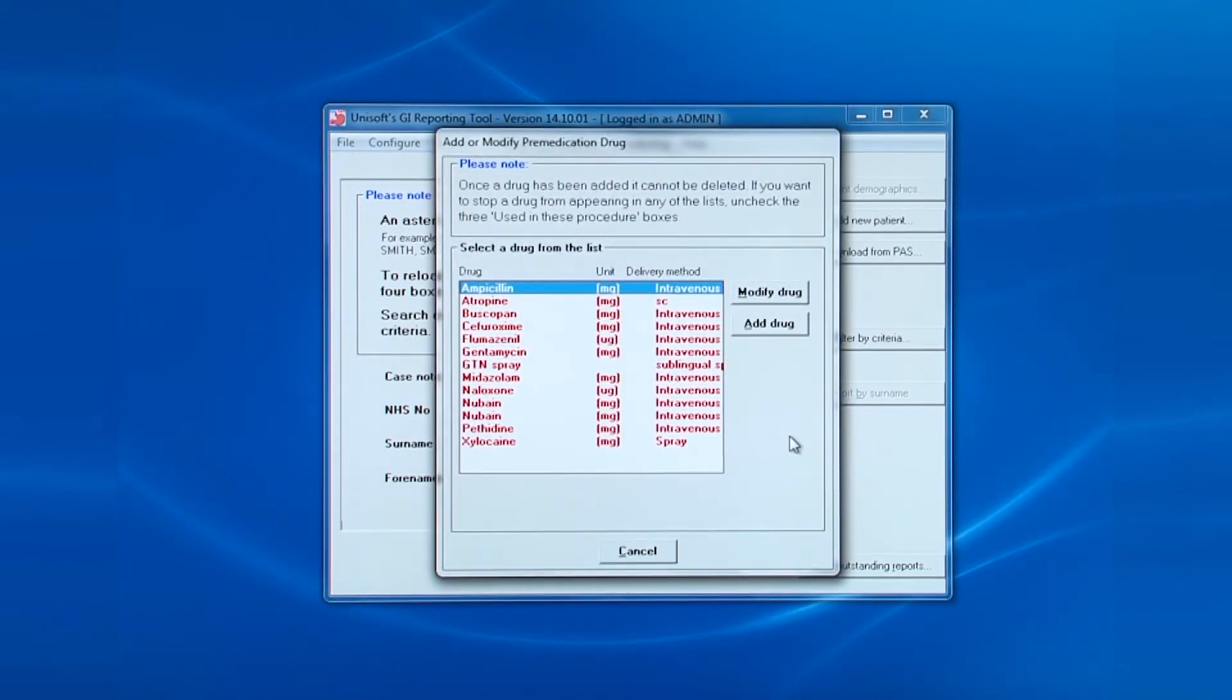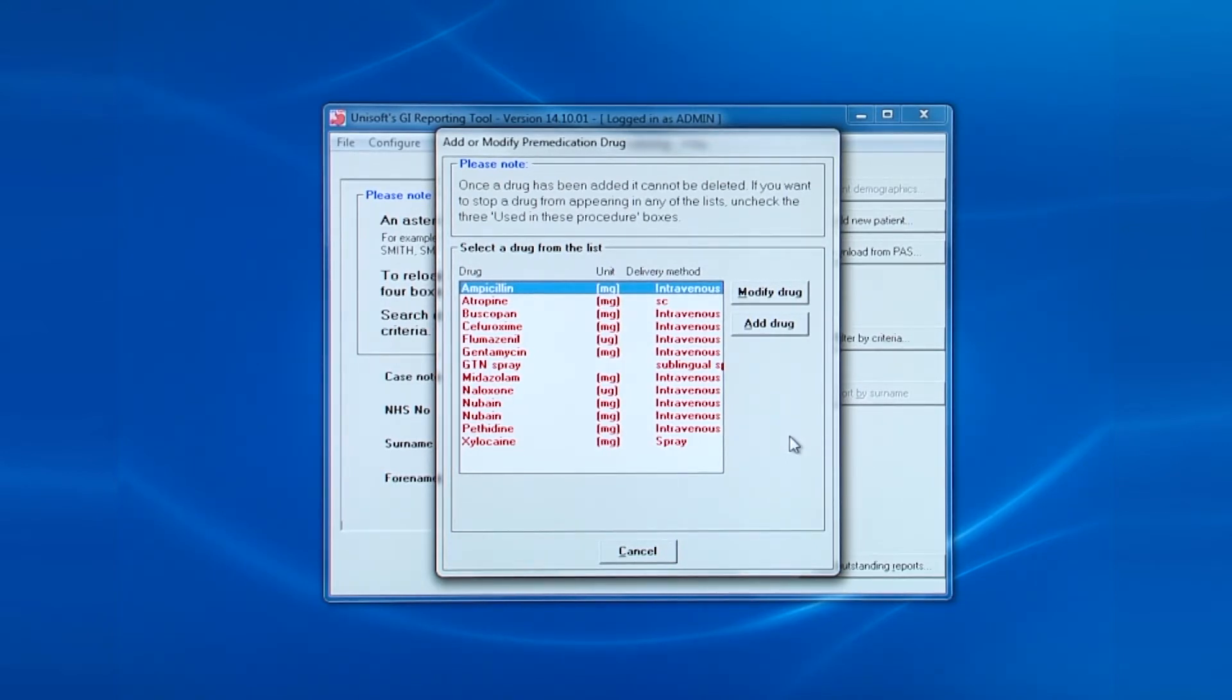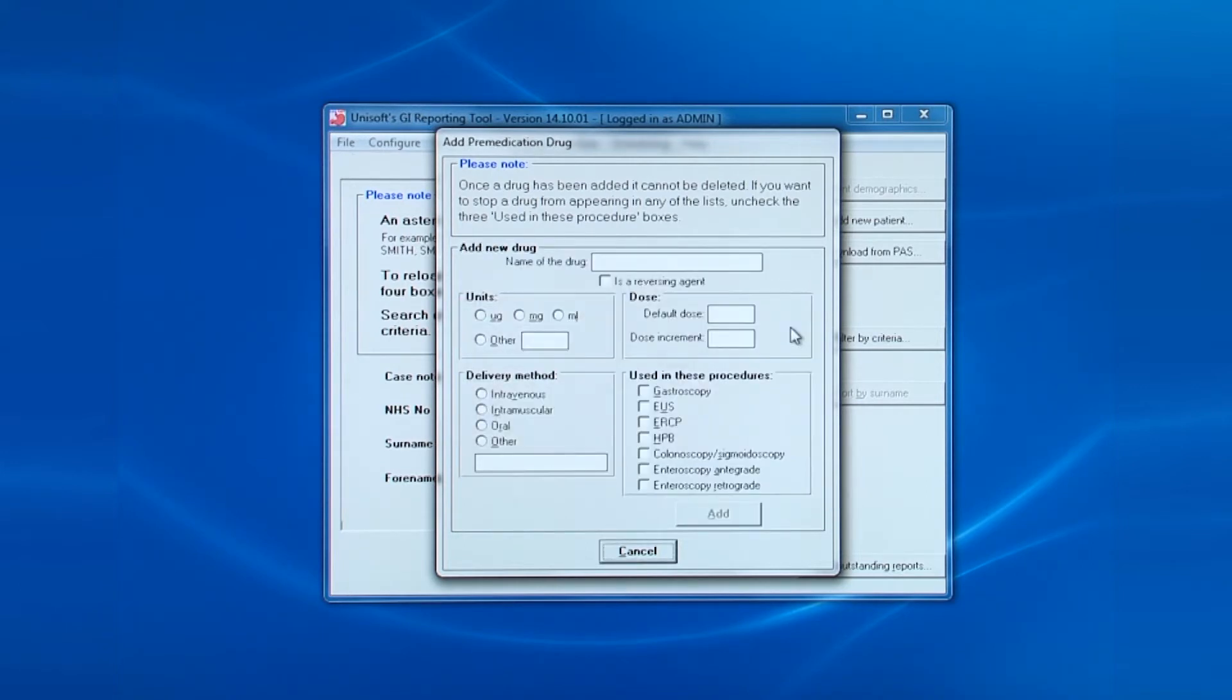Here you can see the pre-slash perioperative drugs already on the system. There are two buttons: modify drug and add drug. Note that alfentanyl is not on the list, so let's add it.